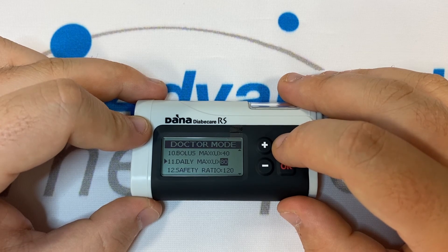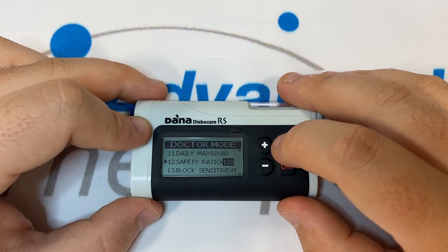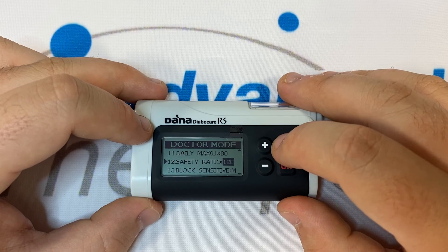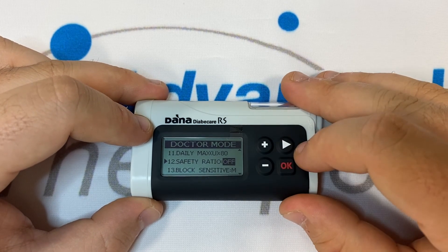Number twelve is Safety Ratio. This is a ratio you can set whereby, if you try to deliver this ratio or above the average size bolus for the last three days, the pump will alarm and suspend. For the most part, we set this to off.